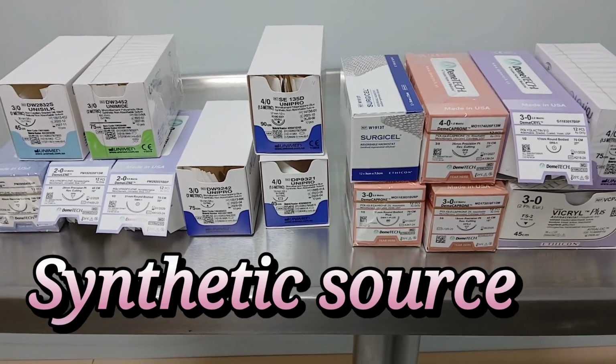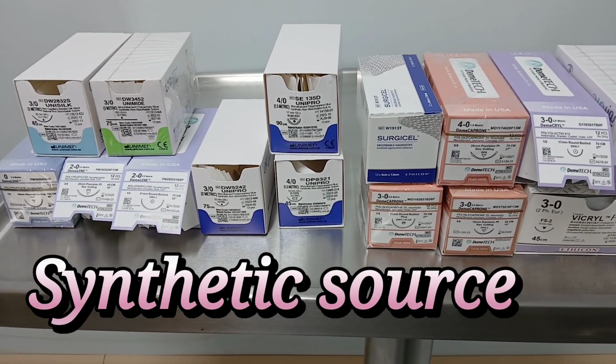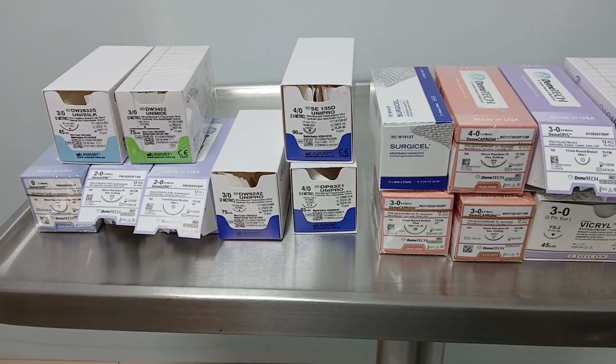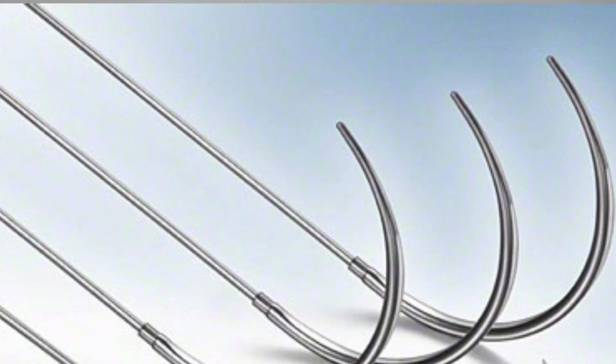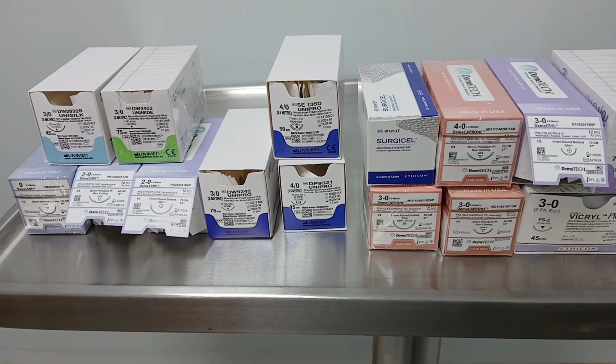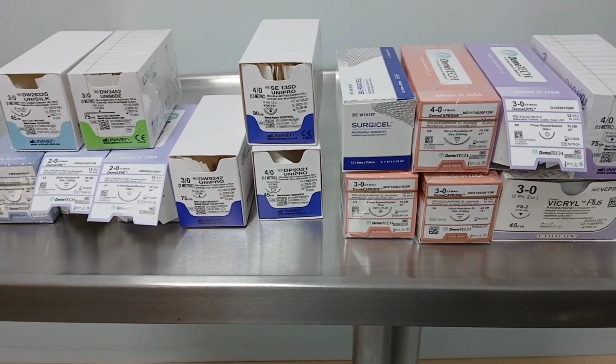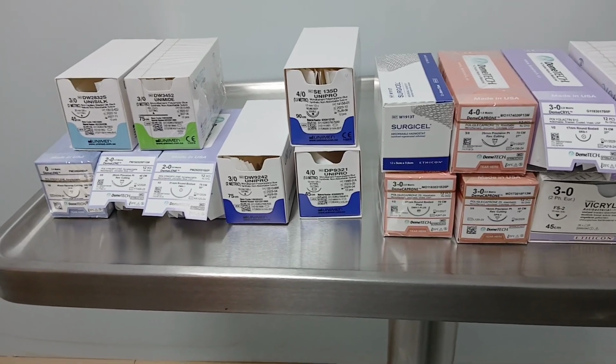Synthetic source means man-made suture. That means artificially the man is preparing the suture. And steel wire we use for sternal closing. So three sources are there for the suture material. First we get from the natural source, then synthetic source, and steel.